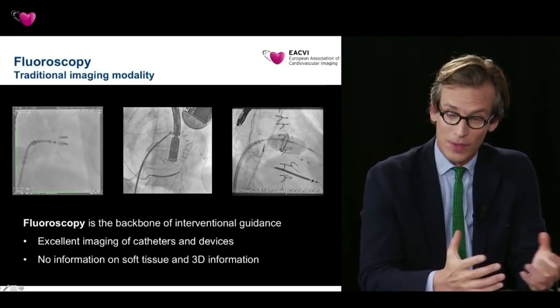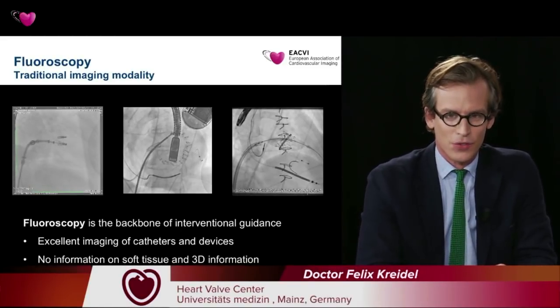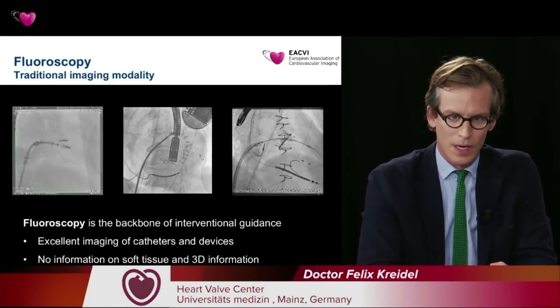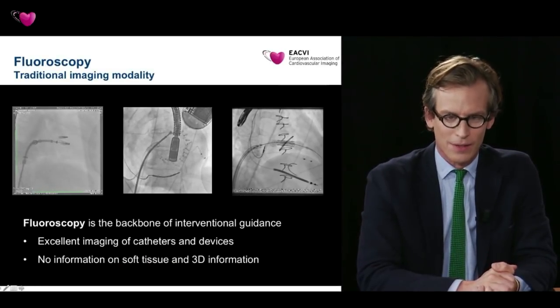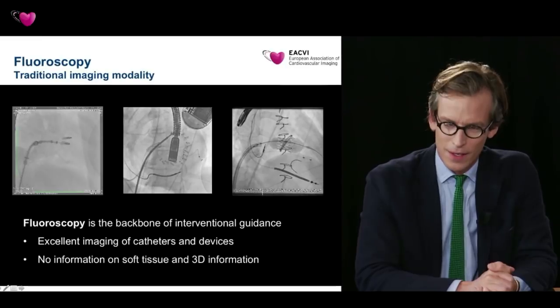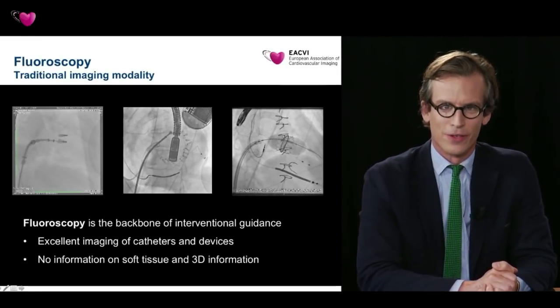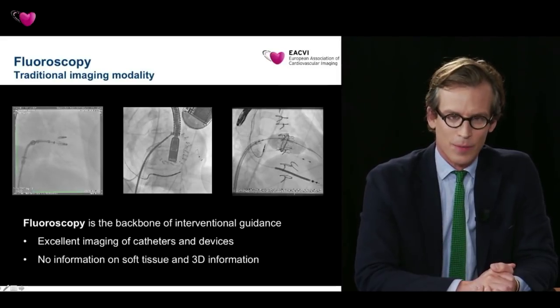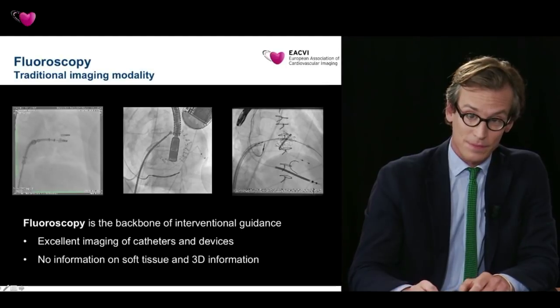Yes, of course, since we're not surgeons and we're not touching the heart, we need imaging to do our job. And number one imaging modality is fluoroscopy, a traditional imaging modality tested in many thousands and millions of procedures, has excellent imaging of catheters and devices, but gives you no information on soft tissue and depth.